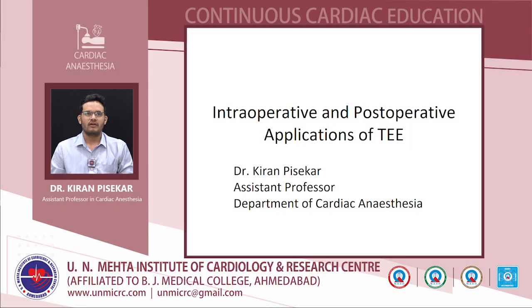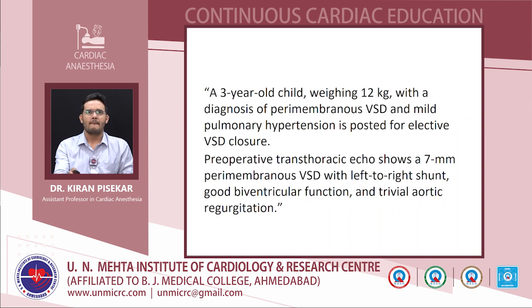Good morning. Today we are going to discuss the intraoperative and postoperative applications of TEE, which is a continuation of the TEE series on pediatric TEE. So let's discuss a case first.